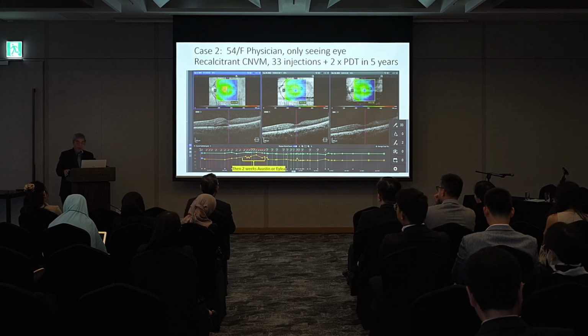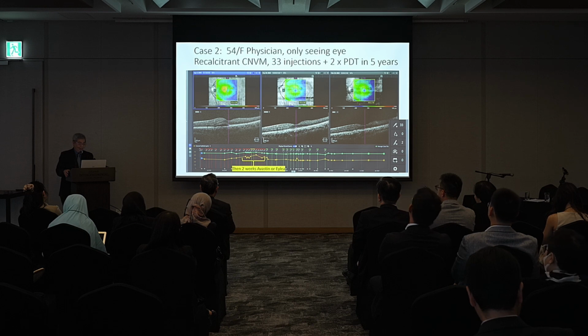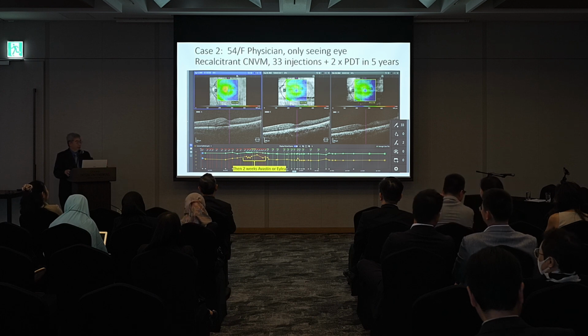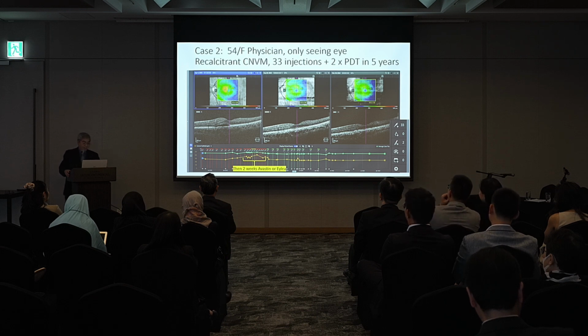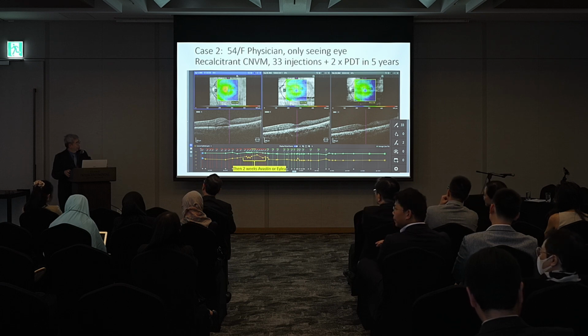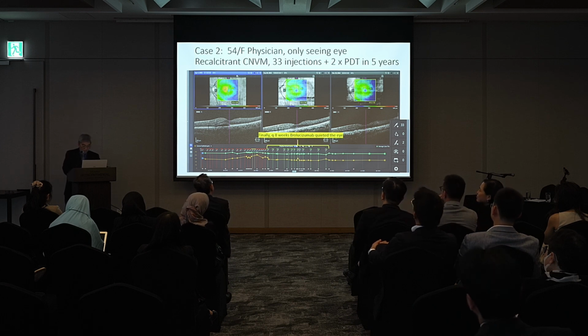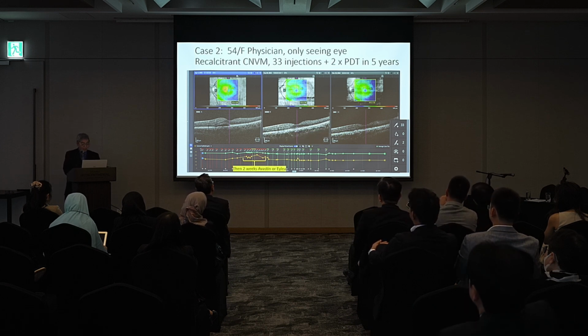And then we decided maybe let's try getting the injections every 2 weeks, which is, I think, quite intensive already. But even with every 2 weeks Avastin, you can see here, down here, that we're not really getting good control. You see that yellow line indicating central retinal edema fluctuating quite extensively. And then we even tried Eylea, that's the yellow line, but you can see that's actually made things worse.